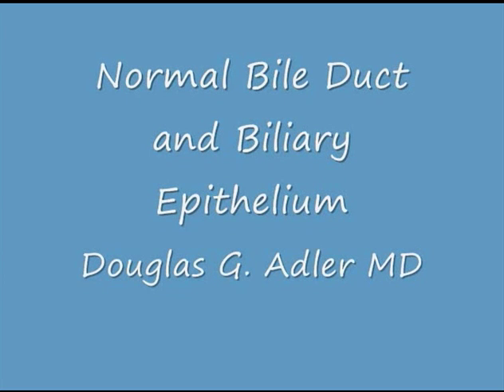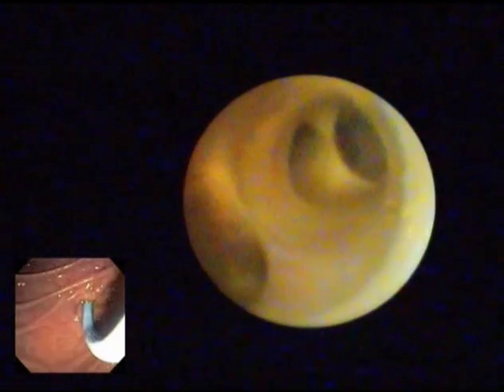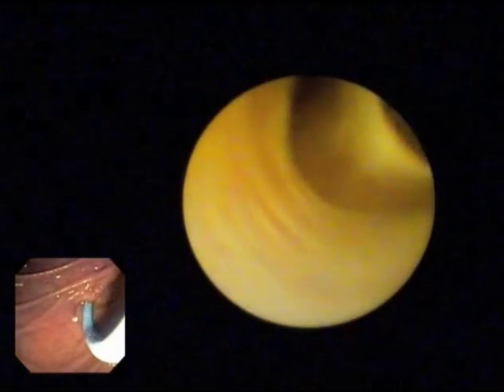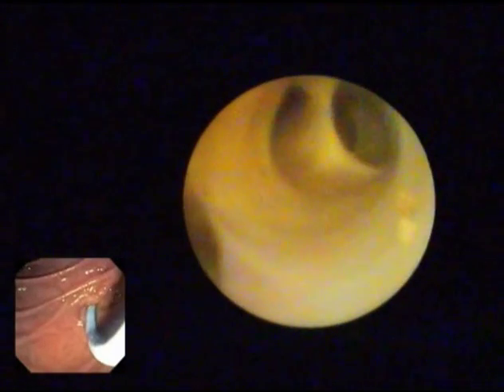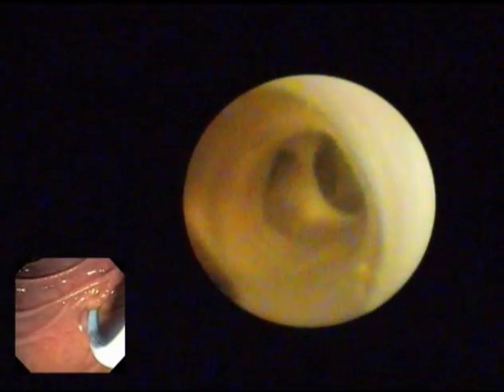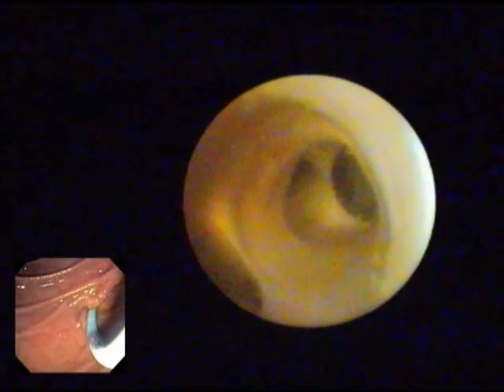A normal bile duct and biliary epithelium. The normal bile ducts have a pale appearance with sharply demarcated ductal origins. Note here a normal bifurcation — the biliary epithelium is pale, sharply demarcated, and there is no evidence of edema or erythema. When looking from below the bifurcation with a single operator cholangioscope, you can easily see into multiple ducts which can be independently accessed.